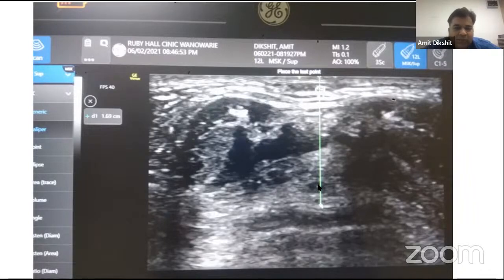One of the important facts is we do not have normalcy data for the Indian subpopulation. As far as I know, Apeksh sir may be telling us more about that. As the ultrasound in this area is emerging, sometimes we have to depend on whatever Western population data is available. As we can see with the size of ET tube in our nation versus those from America or UK. So do not be very rigid about a number, because different studies will have different values. You need to think of a range for all these studies.